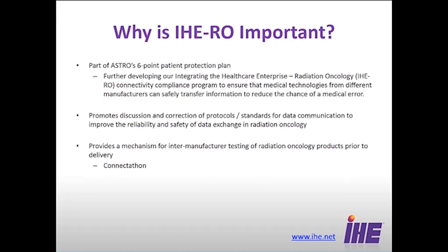Why do we think it's important? Everyone on these committees is a volunteer, so why do they devote their time to this? It's because we really do believe that implementation of IHE-RO and compliance with the profiles will help safe and effective transfers of information in radiation oncology.